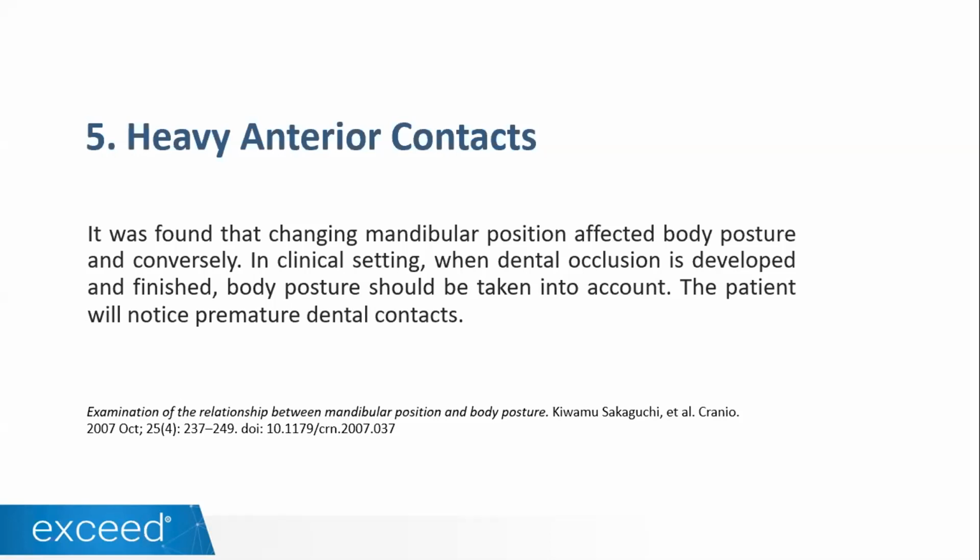So we may need to go and do a refinement just to liberate those teeth out of contact. And this is something that you can actually remember from dental school, or even for the ones that are GPs, that sometimes you go ahead and you make a composite, a class one or a class two, or even just a simple class one. And okay, you adjust the final restoration, the patient is biting, they feel everything is perfect. But as soon as they stand up, they tell you, no, no, doctor, now I have an interference. I feel this is high. Why do they now feel it different? It's because of this. When the patient stands up, the position of the mandible is going to be different. So this is something for us to take into consideration.